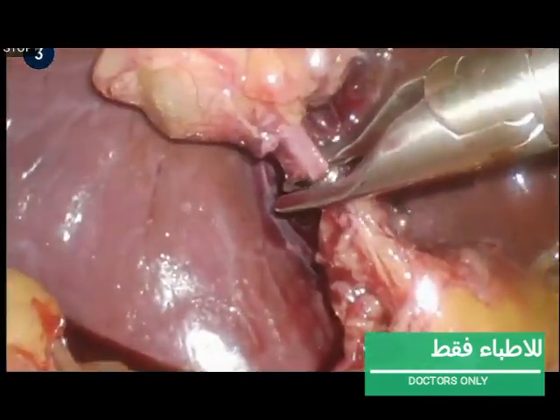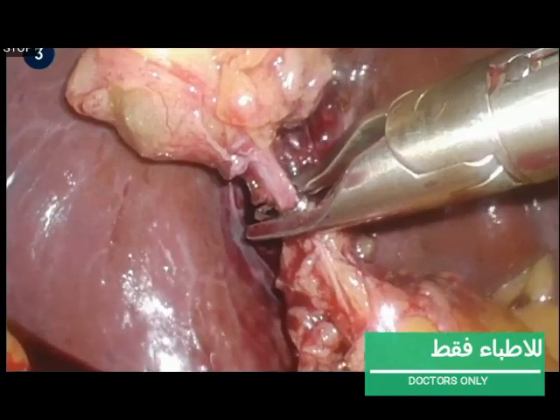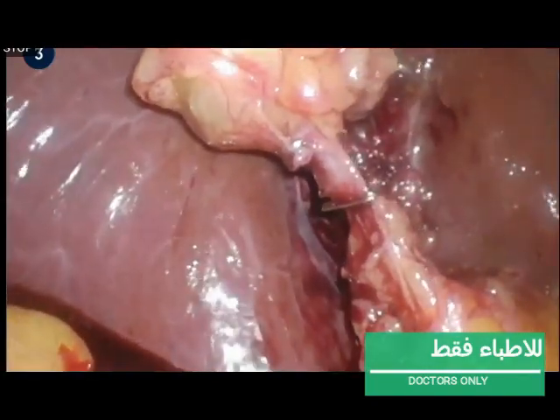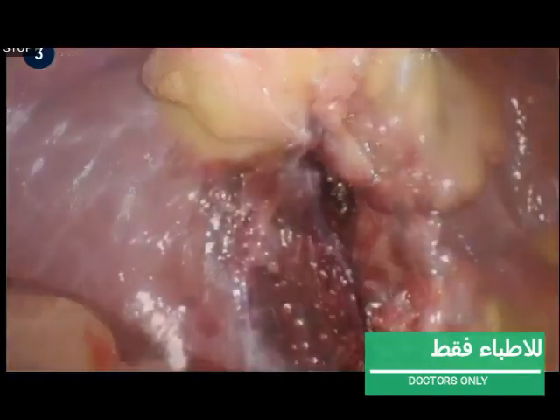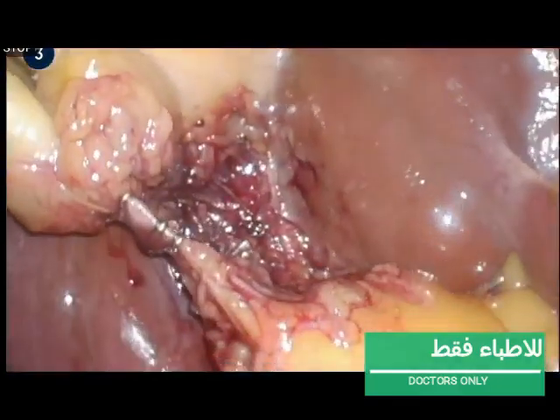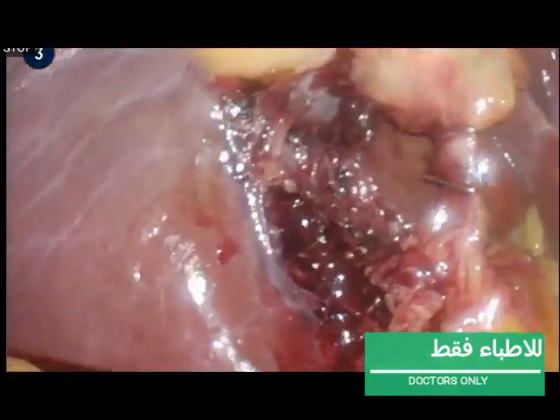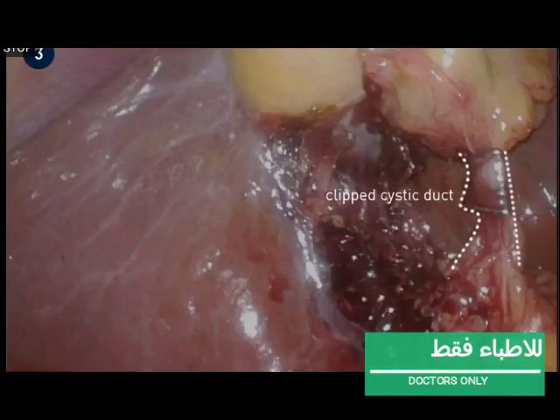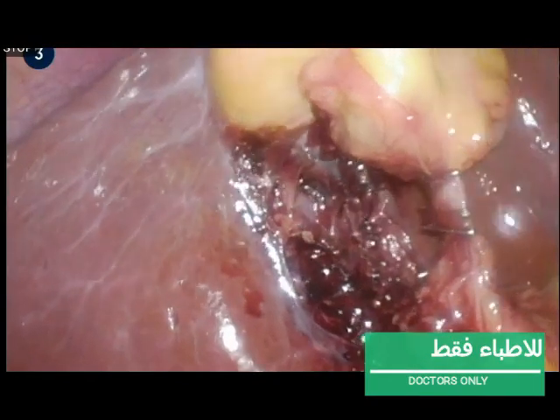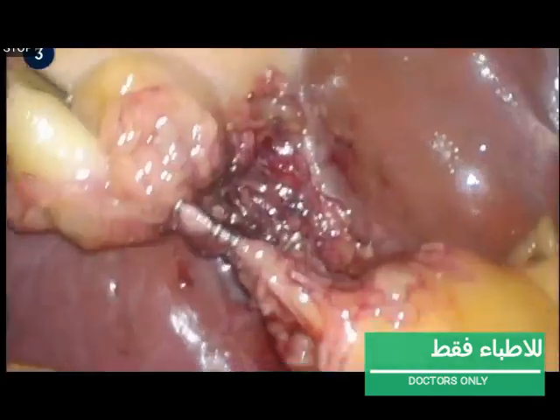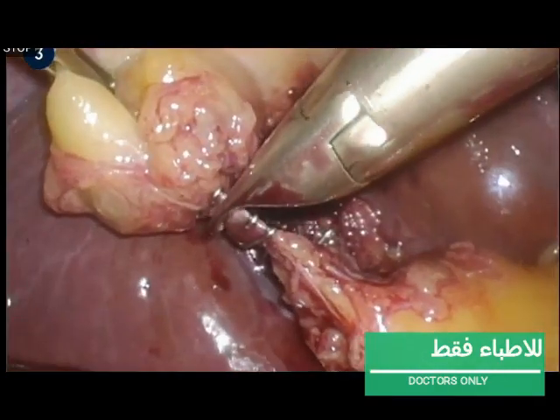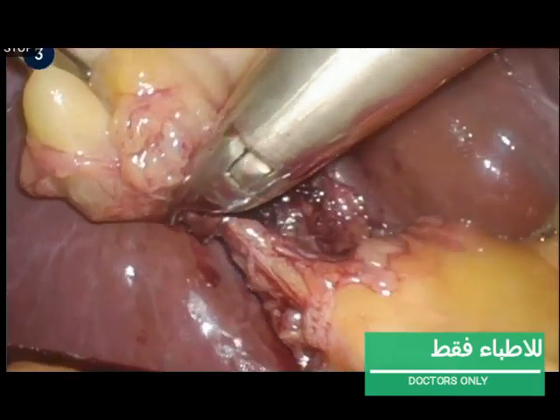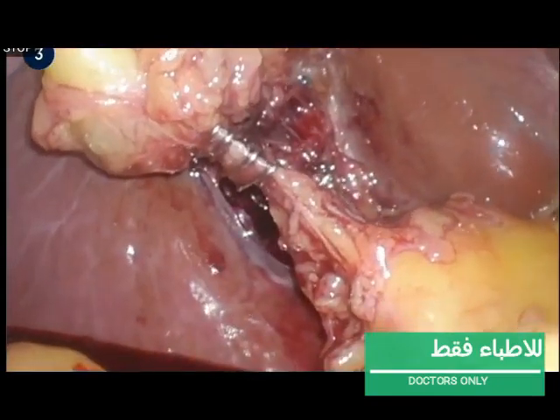The cystic duct is ligated and transected by placing two distal and two proximal clips on it, using the gallbladder as point of reference. Make sure no other tissue is involved before clipping. This overview shows the clipped cystic duct without the involvement of surrounding tissue. A fourth clip is placed and the cystic duct is transected.